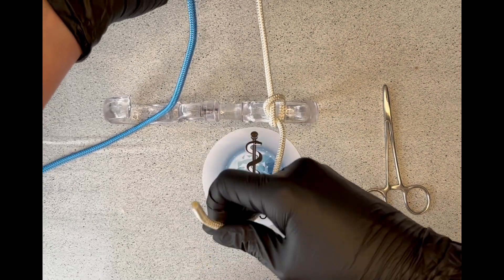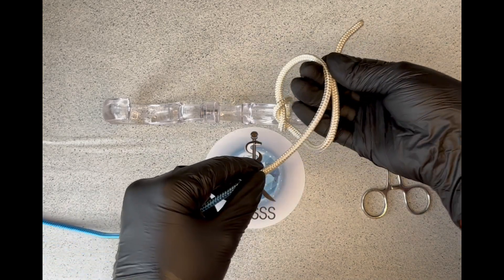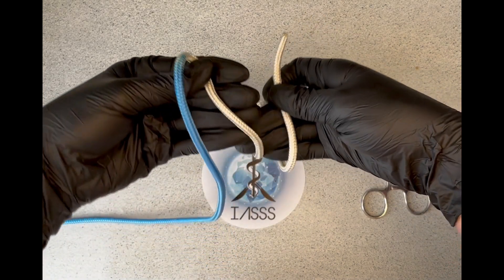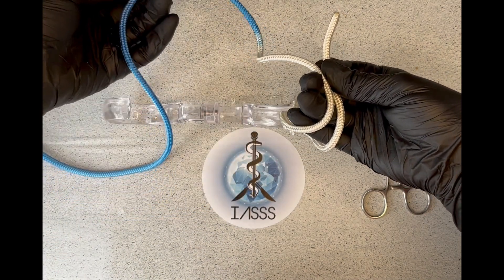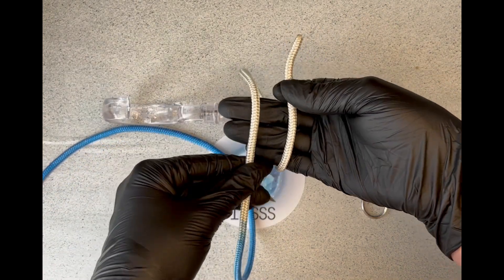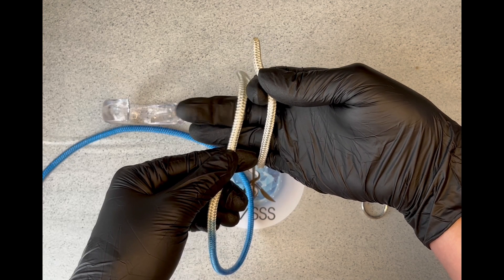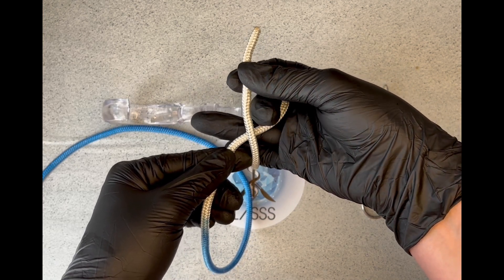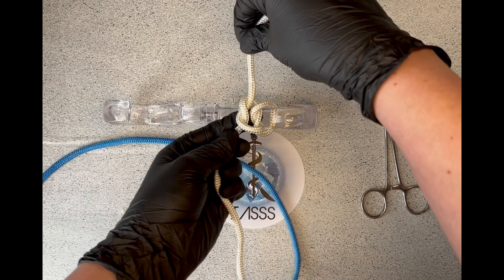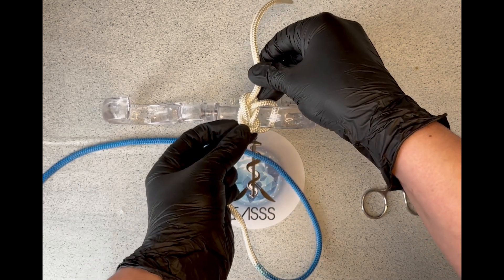This free hand then flips over and you bring the needle end into a loop over your hand, which creates a beautiful circular loop. Some people make the mistake of not letting it fall over the hand but bringing it the other way around — you can see it's not as round and loopy as it should be, so be careful of that. Now you've got both pieces lying parallel to each other. Take your middle finger over the outside, under the inside and use that to push the free piece down and extend it away from you. That brings your knot into a beautiful reef knot shape — a secure knot that will keep the tissue in place and won't slip.